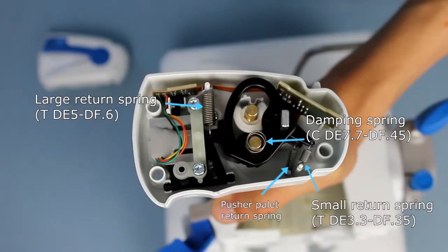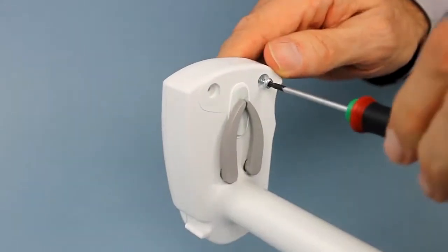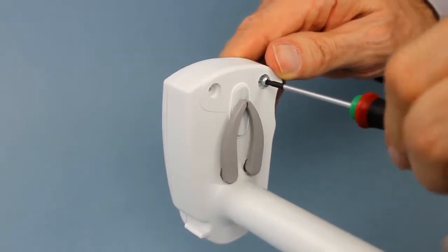Check that the force springs are correctly positioned. Keep the flange in contact with the pusher while screwing.